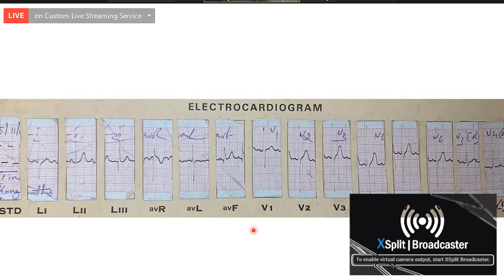Okay, what is this? What is this electrocardiogram? What does this electrocardiogram show? This is an electrocardiogram of a 3-month-old baby. Sir, sinus rhythm. Okay, sinus rhythm.